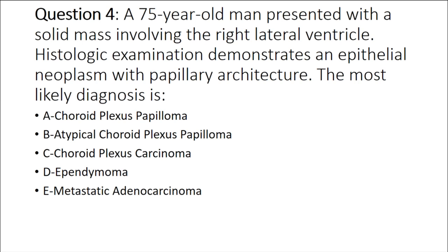Question number 4. A 75-year-old man presented with a solid mass involving the right lateral ventricle. Histologic examination demonstrates an epithelial neoplasm with papillary architecture. The most likely diagnosis is... I see an answer choice as metastatic adenocarcinoma by some.